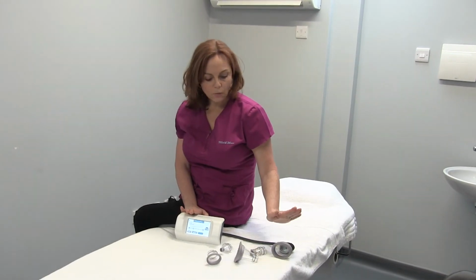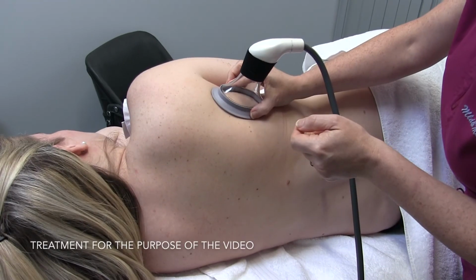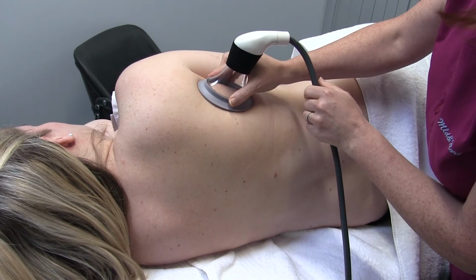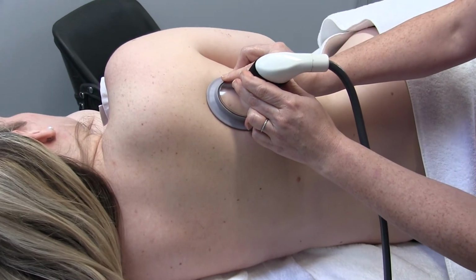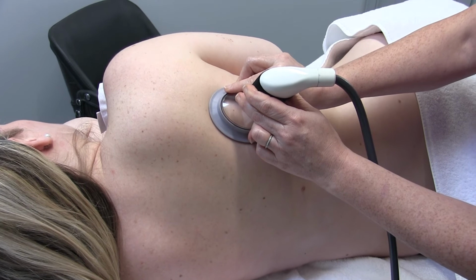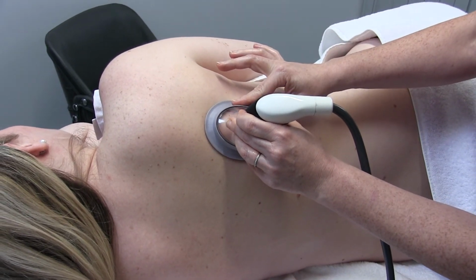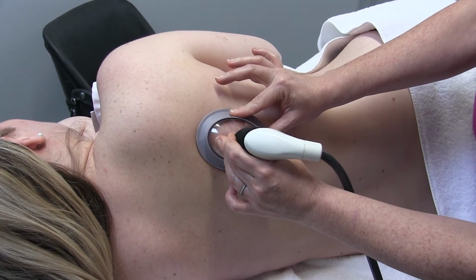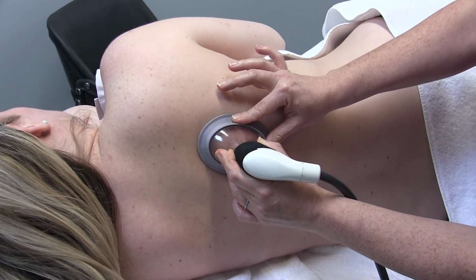I use this with the HYVAMAT. Quite often I do have my gloves on and I'm using the HYVAMAT, but then I will have this depending on the area I'm treating. So if I'm treating somebody who's got lower limb lymphoedema, I will have them on their side perhaps, and have the cup fixed because it's able to stay attached to the skin, which is wonderful. So it's pumping for me whilst I'm using the HYVAMAT, helping with lymphatic drainage.